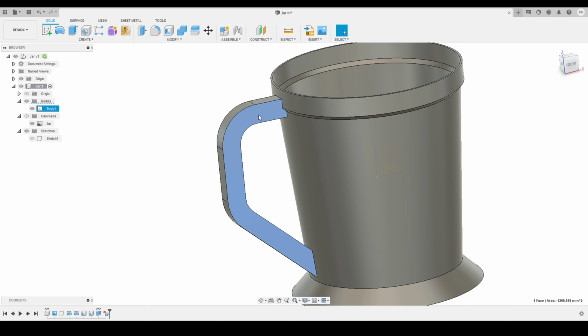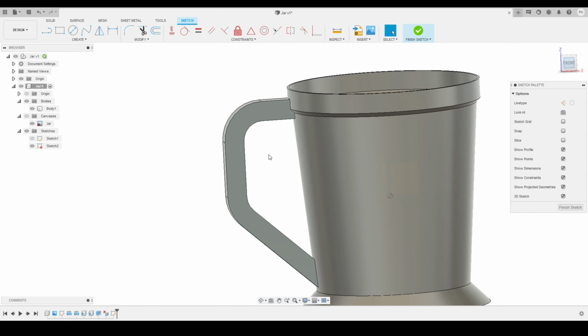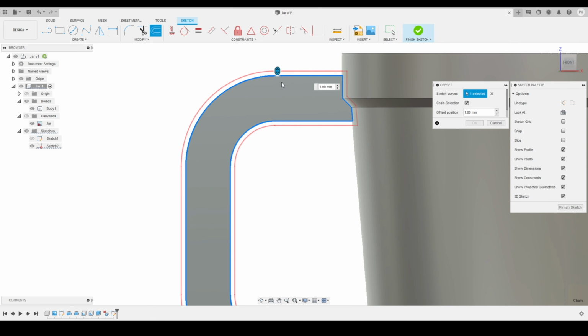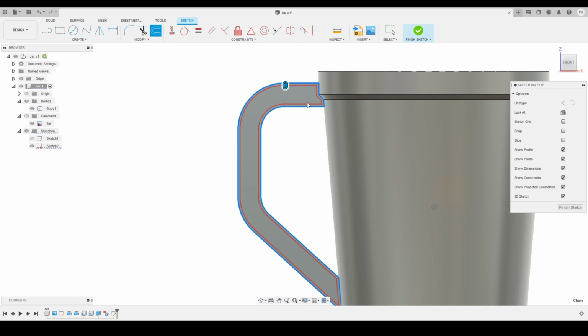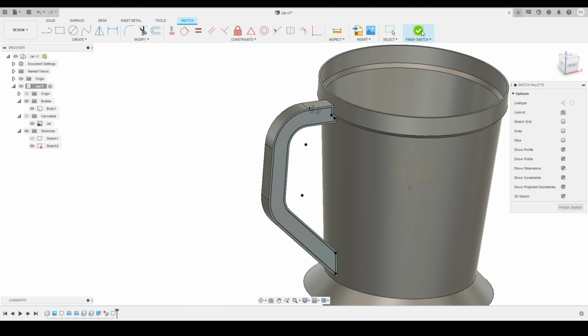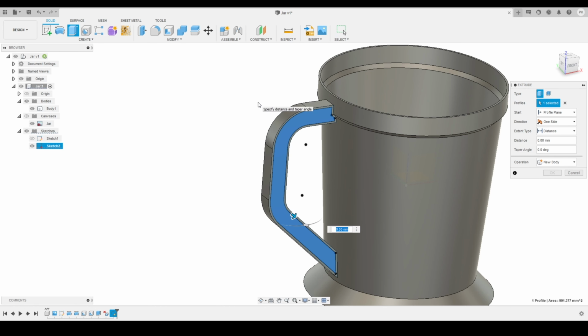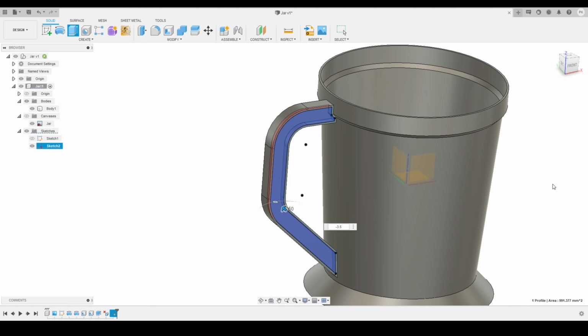The next thing is that I have to make a groove on the handle, so we'll select the face, activate our sketch tool, go to the front view, and activate our offset tool from here. We'll select the profiles and offset it by minus 1 millimeter inward. Here you can see, and we'll press OK, and click on finish sketch for now. I will activate my extrude tool from here, select the profile, and make an extrude cut by minus 3.5 millimeter. Here you can see, and we'll press OK.